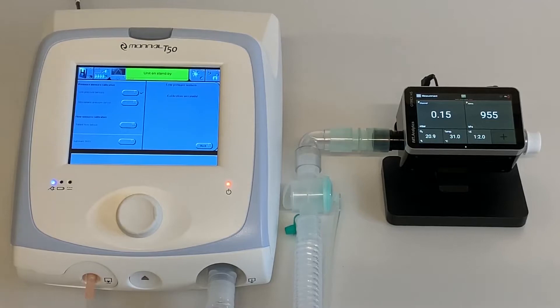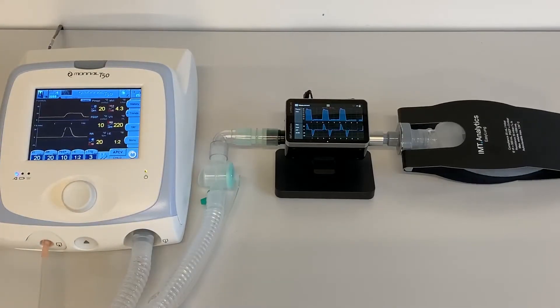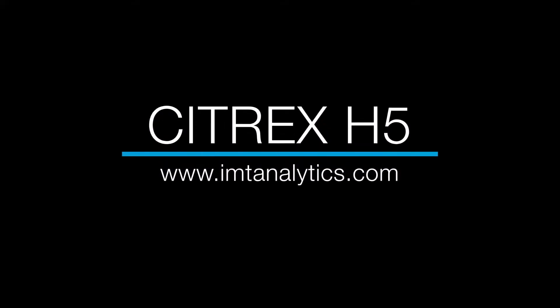When the test is successfully completed, the Monal T50 ventilator is ready to use. Citrex H5 — available at IMT Analytics.